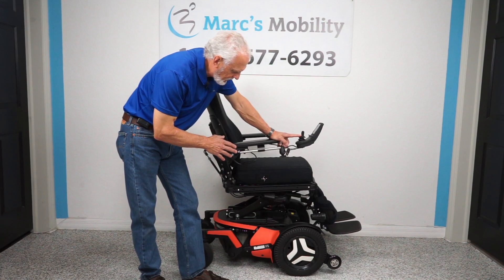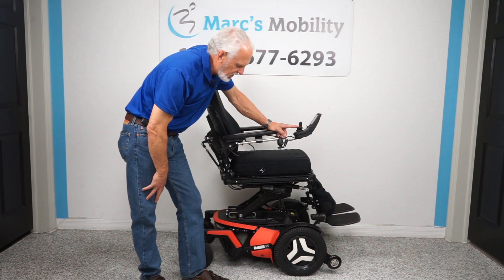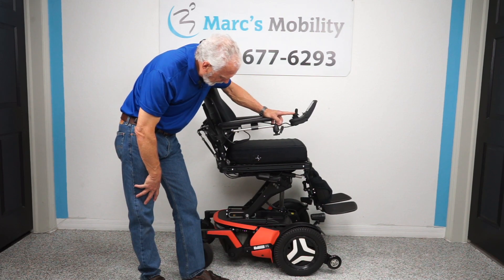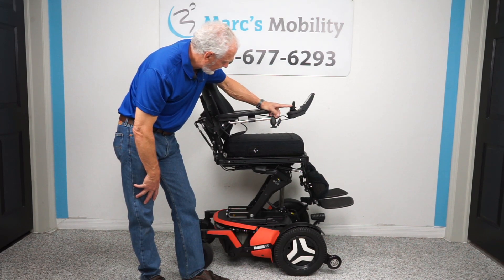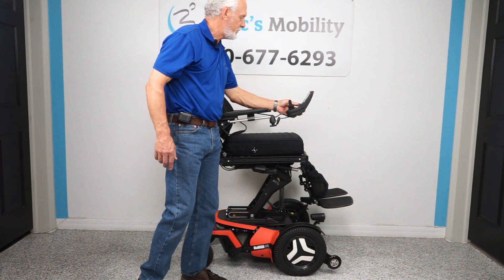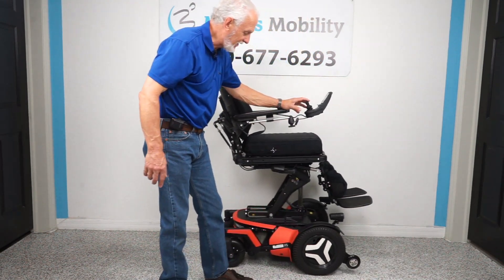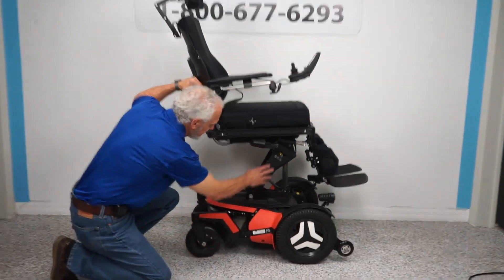The nice thing about this chair: once the seat is all the way up 14 inches, you can still drive the chair at a good speed — reduced, but you'll still be able to drive it. So we're all the way up. If you were sitting in this chair right now, I'd be talking to you at eye level. Let's put it back and drive — you can see with the seat elevated how it wants to take off. That's a fast chair.